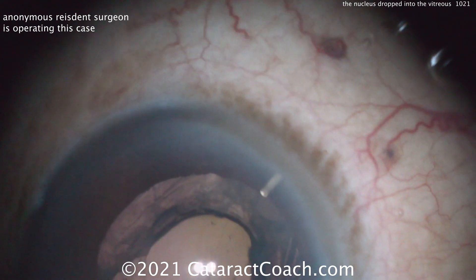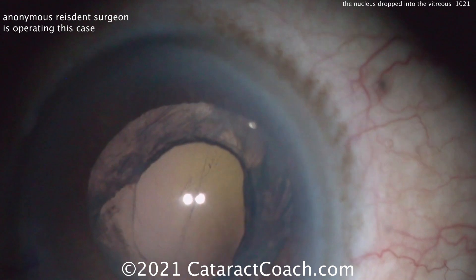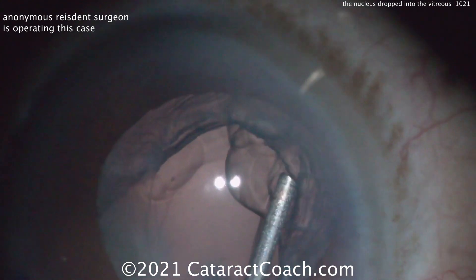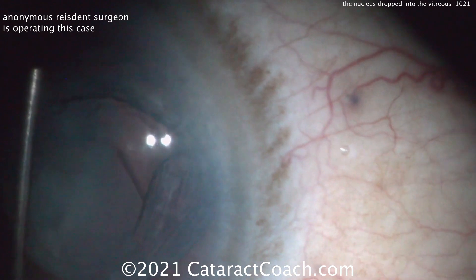Oh my goodness. And even worse, you pulled the Faco probe out of the eye. By doing that, you let the anterior chamber pressure go to zero, so a lot more vitreous prolapsed forwards. Let's put some viscoelastic in.